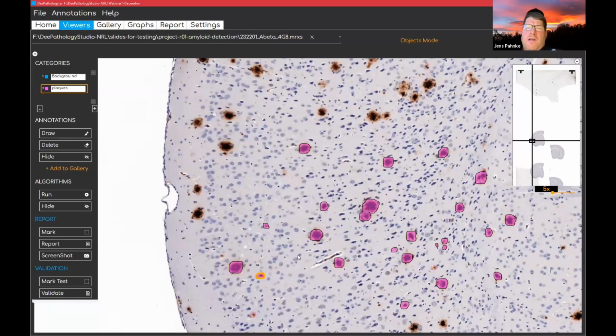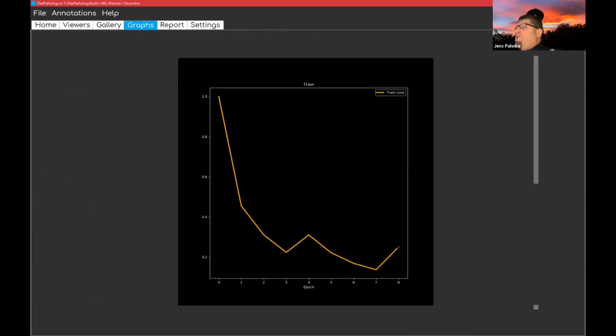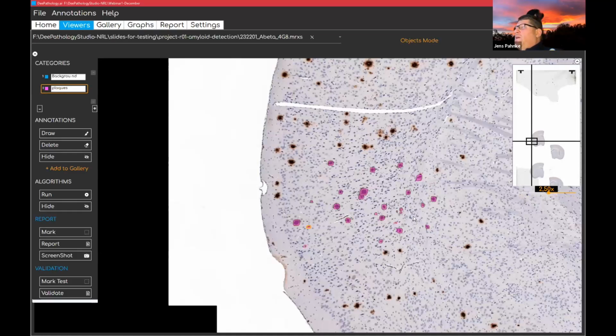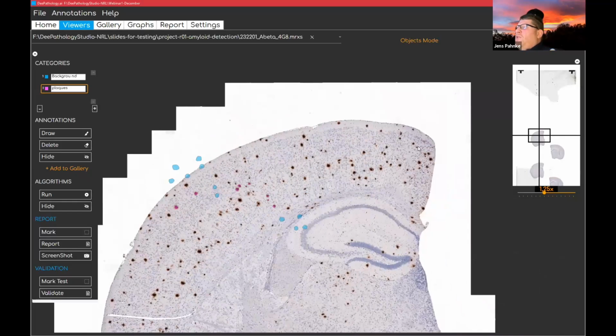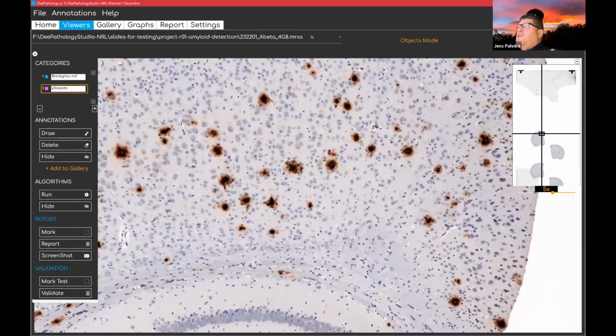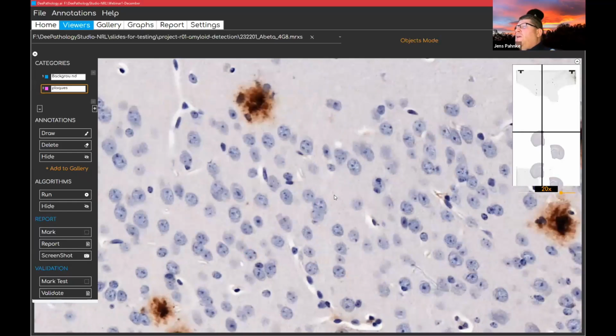We have not been working long here. It is 15 minutes, including the introduction, and we already have a tool that is detecting plaques in a perfect way already at the first run. So we have 8 epochs now. Usually I let it run till 25, 30 if I want, and then I can do the detection. So what you see here now is very easy. I go to another place. I said, okay, good. Let's check this here again, whether it's working properly or not.